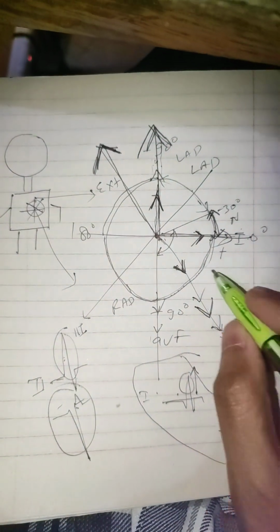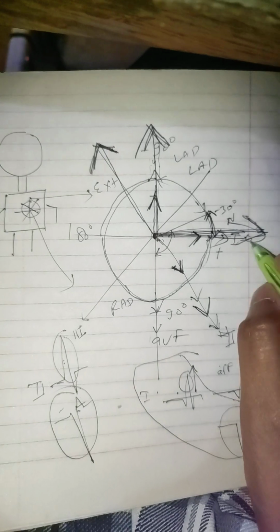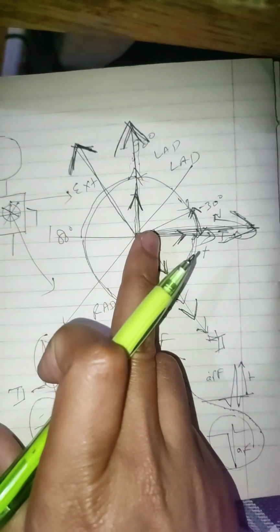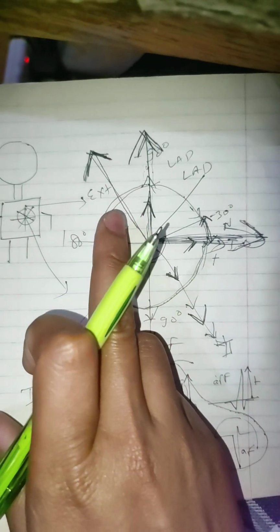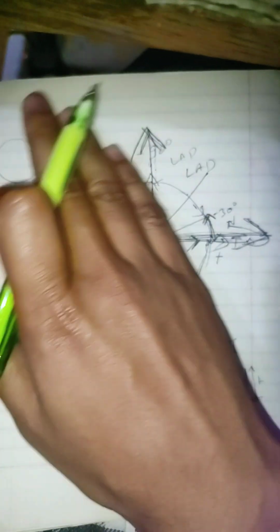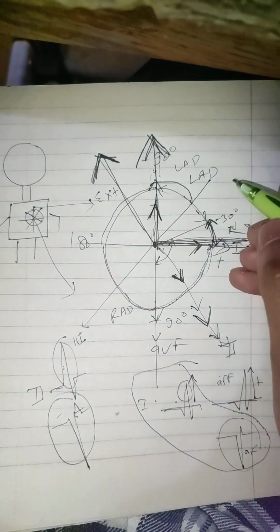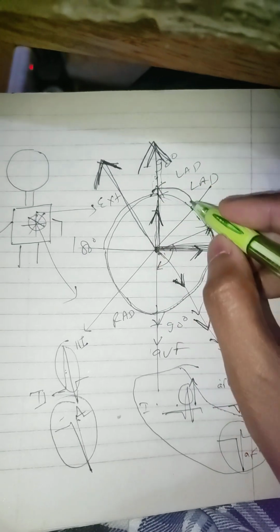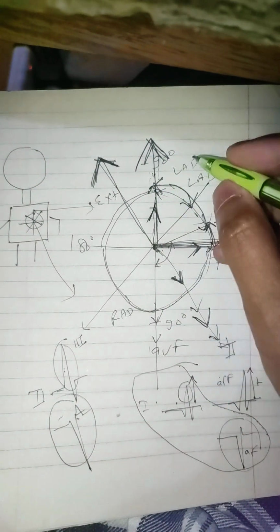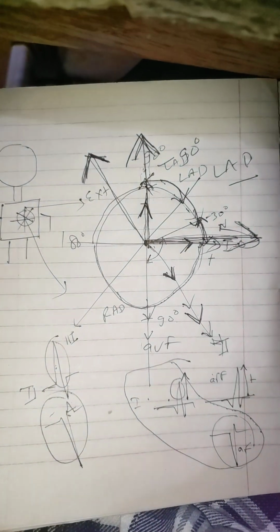So now imagine the condition like this. Two vectors are going in this direction and one vector is in this direction. If you sum up the magnitude of both, it is leaning toward this side. That's why most likely the cardiac axis will fall between minus 30 to minus 90 degree, or left axis deviation.